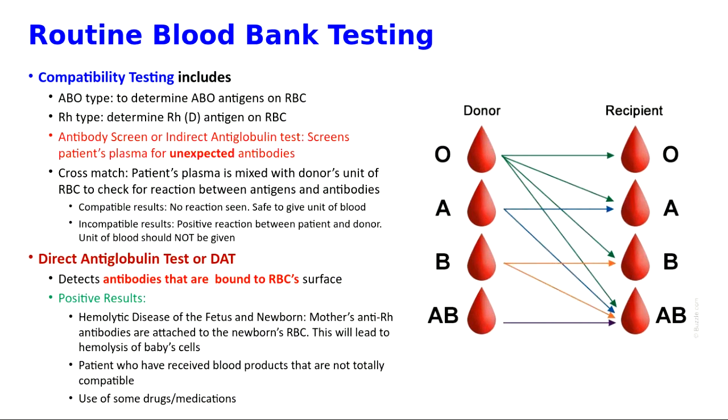And on the right, some drops of blood here. This is just to illustrate that if the donor is type O, they have no A or B antigens of the ABO family. They can give red blood cells, right? This is only red blood cells, whole blood. An O donor can give blood to an O patient, an A patient, a B patient, and an AB patient. That's why we say that O blood type is a universal donor. And we're talking about red blood cells only, okay?